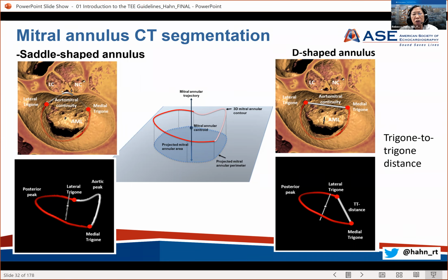Remember, we're tied to the esophagus. There's nothing I can do about where the esophagus is. Obviously, we try by using the flexion wheels. But sometimes it's just not possible, as you've intimated, that we just can't get to it. So absolutely, we've got a transthoracic probe with us, and we go ahead and get the PW of the RVOT and typically the LVOT from the transthoracic. Okay, I'm going to keep going with the mitral annulus.